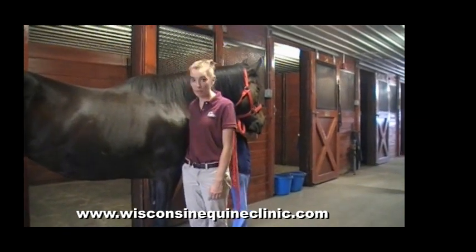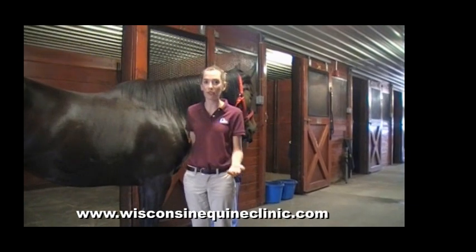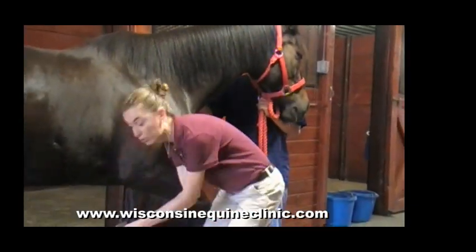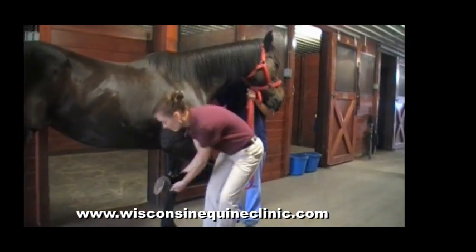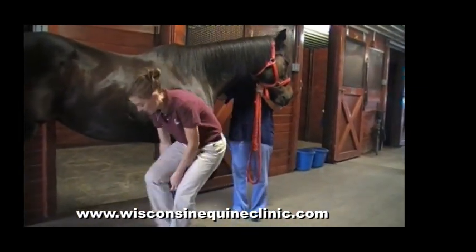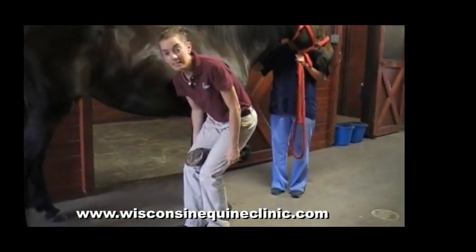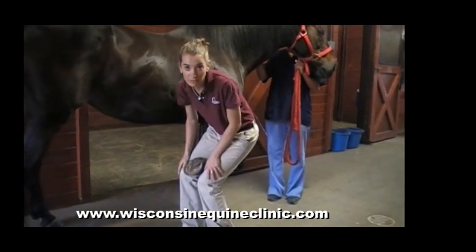Now to demonstrate how to apply the bandage to your horse's hoof. If you have two people or a difficult horse, it can be helpful if one person helps you hold the leg while you apply the bandage. With LB, since she's such a good little girl, I'm going to do it with the leg between my legs, holding the hoof like this, and then I can just grab from the ground on a clean surface all of my supplies.